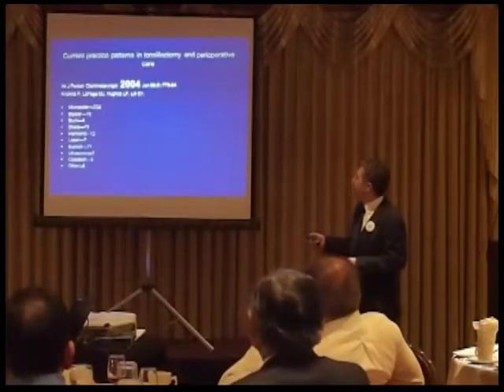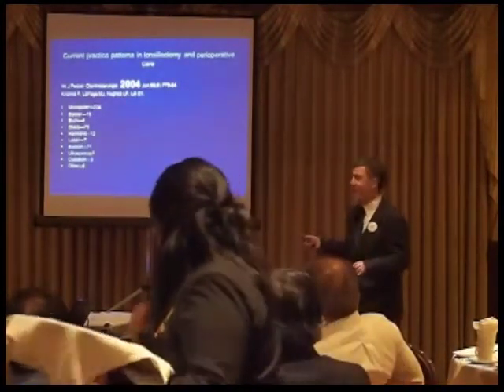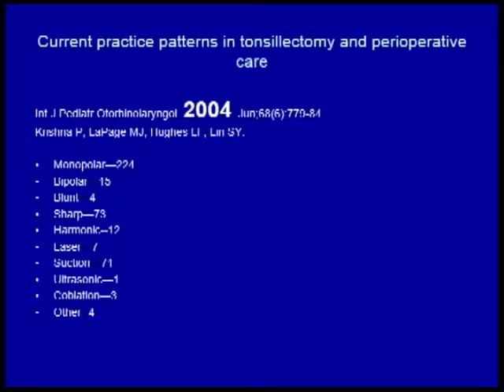And so, remember, 1984 was something like a hot paper where they say this new technique of cautery. And then by 20 years later, they did a survey of about 400 ENT doctors, otolaryngologists, and by then, monopolar cautery 224, bipolar 15, blunt dissection 4, sharp dissection 73, harmonic scalpels 12, laser 7, suction cautery. Actually, one of my co-residents, I asked him, 4 or 5 years out of residency, how are you taking out the tonsils? He uses a suction cautery. I didn't really know you could cut that well with a suction cautery, but I don't know you can. Ultrasonic, which I think is the same as harmonic scalpel.